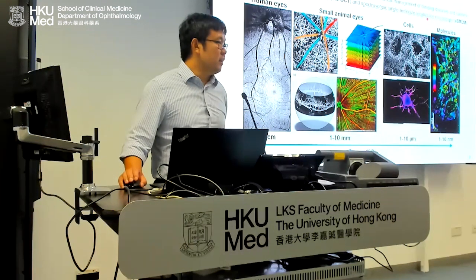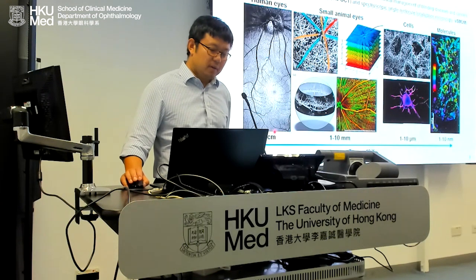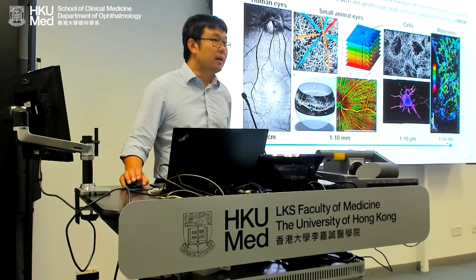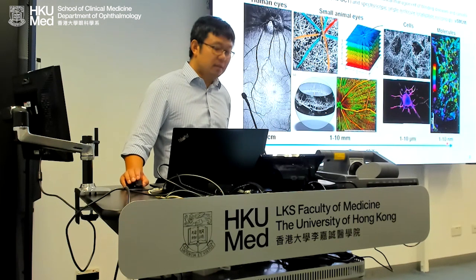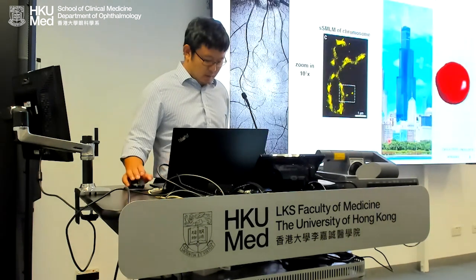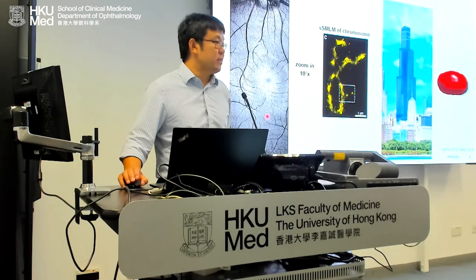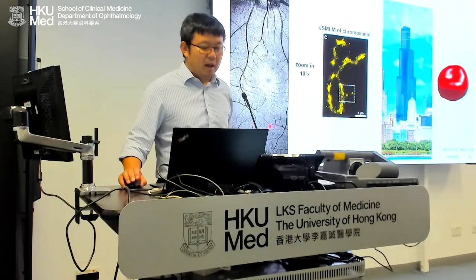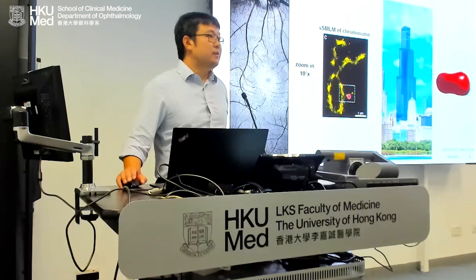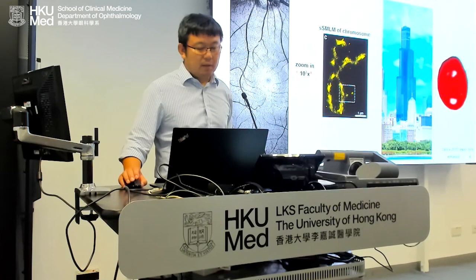super resolution with OCT. When we say multi-scale, the scale is from 1 to 5 centimeters, which is the human eye, to 1 to 10 nanometers, which is single molecules. That's 10 to the power of 7. If we zoom in, this is a human eye acquired by our machine, visible OCT. It's not my eye. My eye is not as healthy. And this is a chromosome from a mouse-derived cell. That's the 10 to the power of 7.